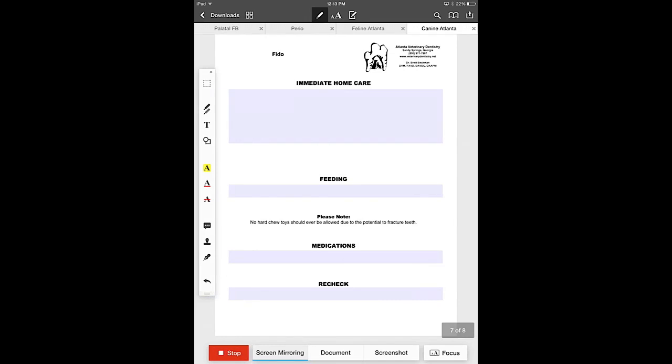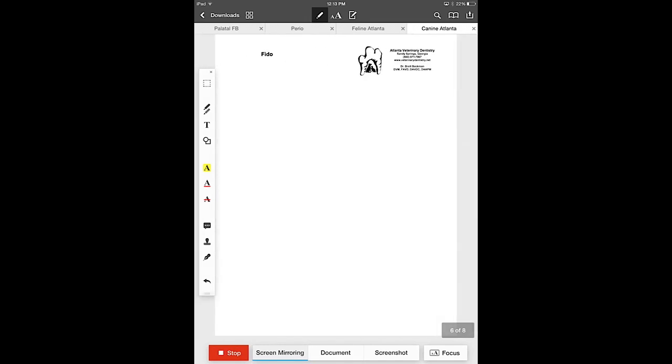Let's go back to our client information page. This is what we create to show the clients exactly what we did in the procedure. So it's extremely easy to get your images into the iPad and then put them directly into this image sheet.